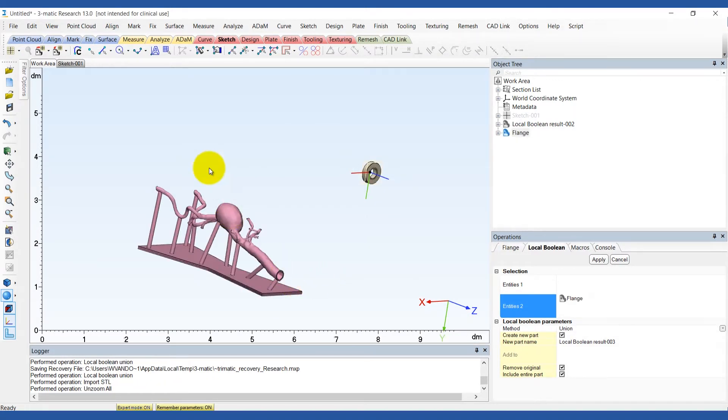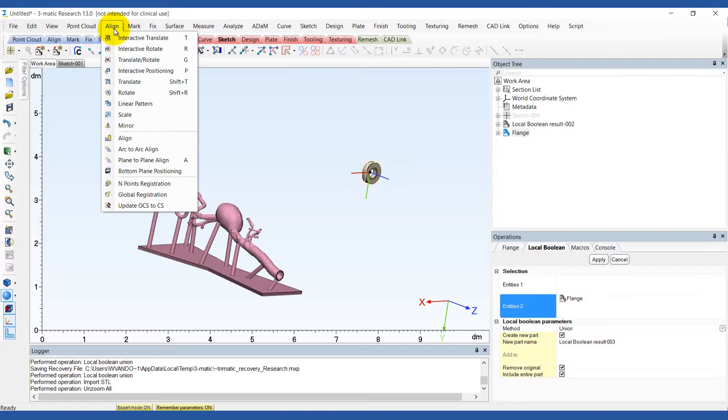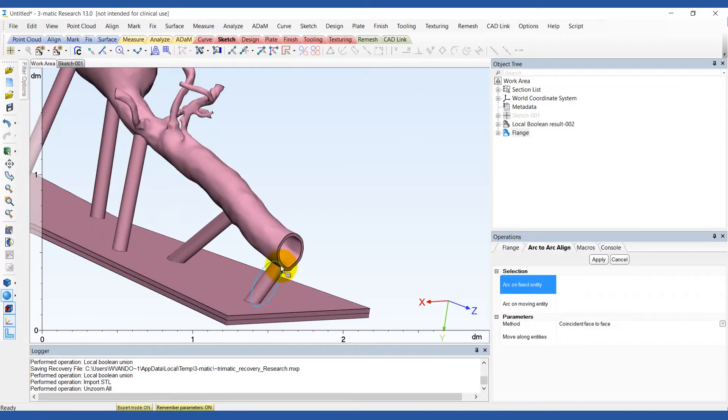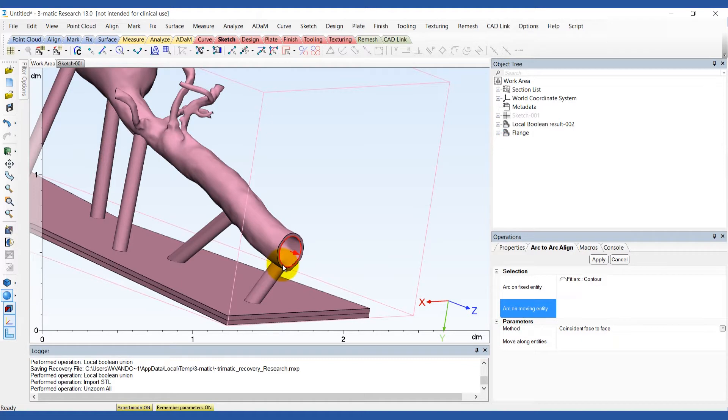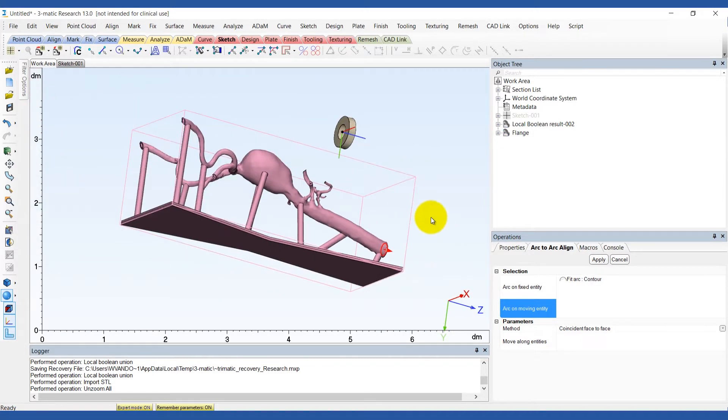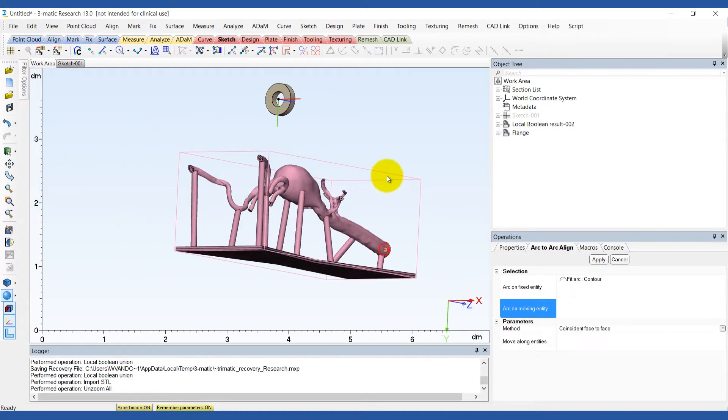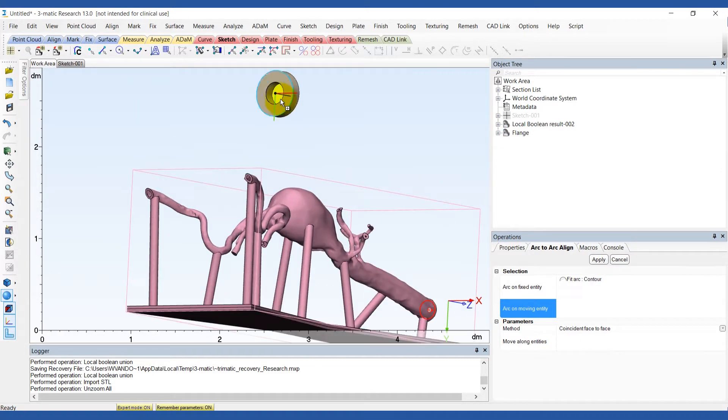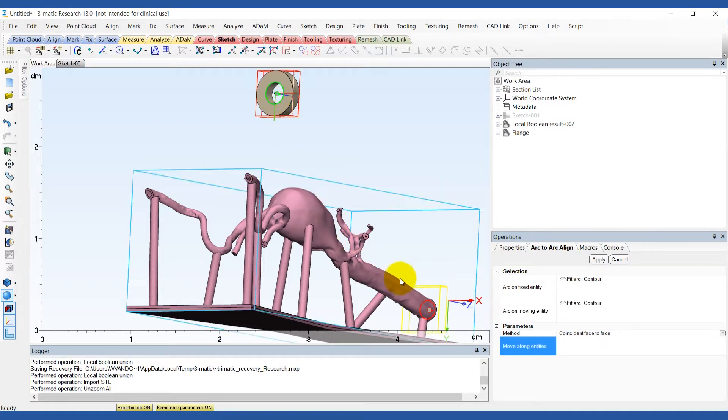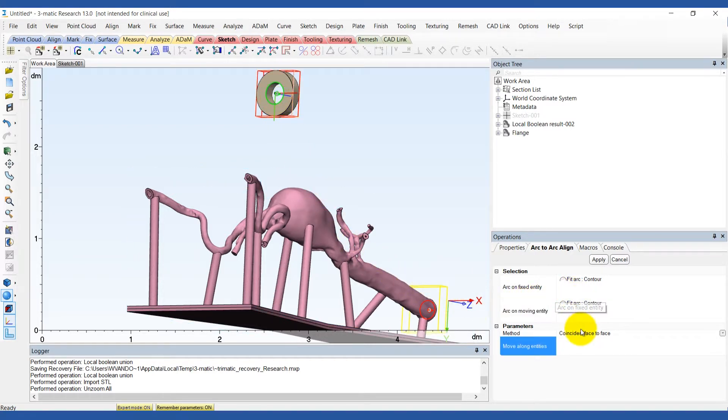To place the flange in the right position, use the arc-to-arc align option in the align menu. We'll select the inner contour of the superior end of the AAA model as the fixed entity and the inner contour of the flange as the moving entity. Choose the coincident face-to-face method.